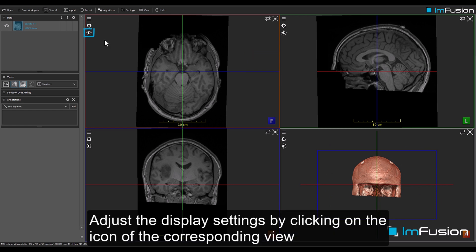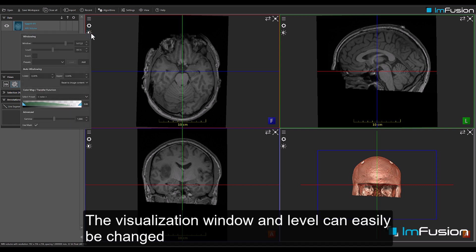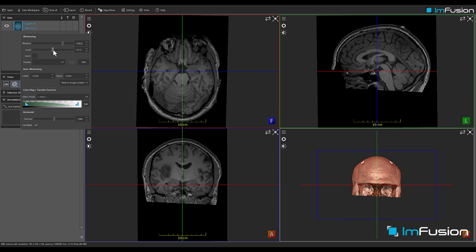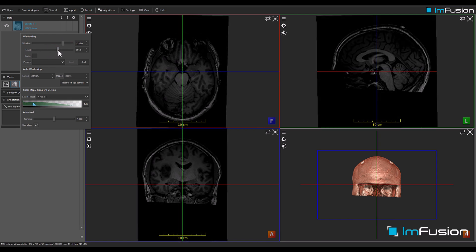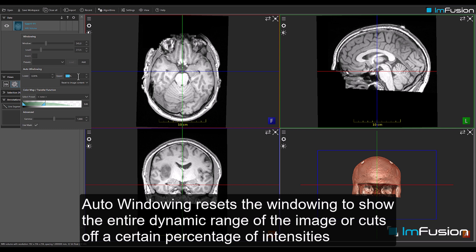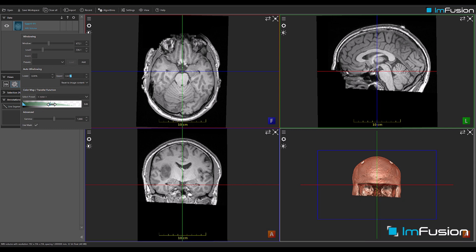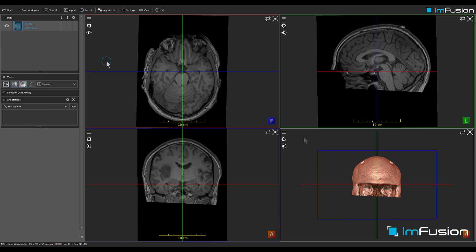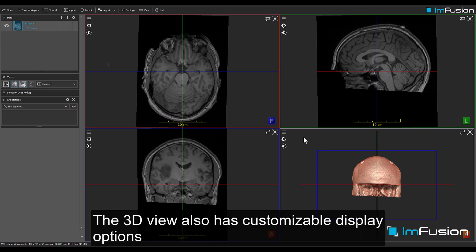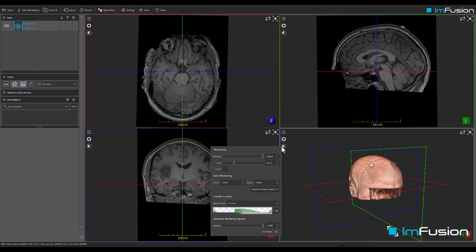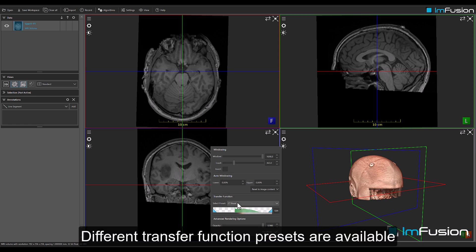Adjust the display settings by clicking on the icon of the corresponding view. The visualization window and level can easily be changed. Auto windowing resets the windowing to show the entire dynamic range of the image, or cuts off a certain percentage of intensities. The 3D view also has customizable display options, including different transfer function presets.